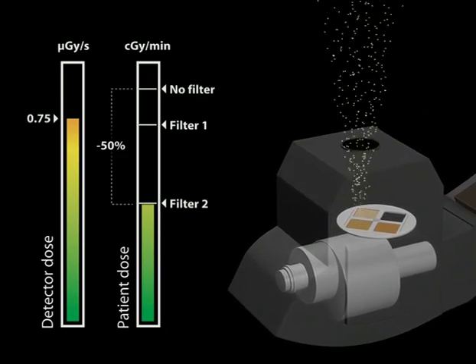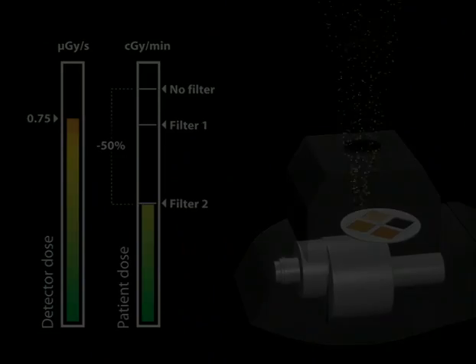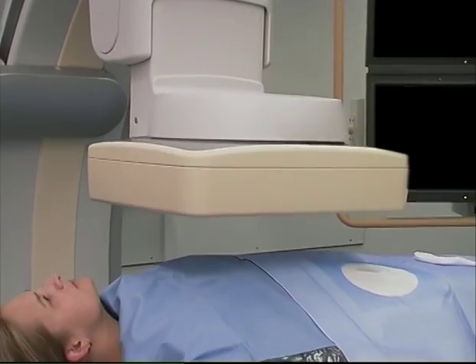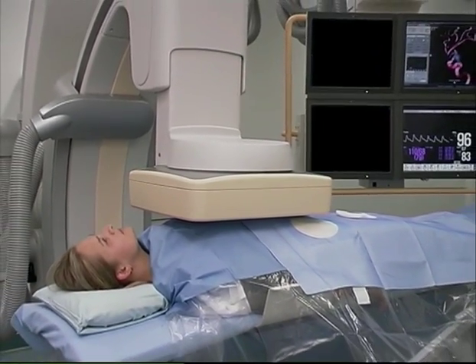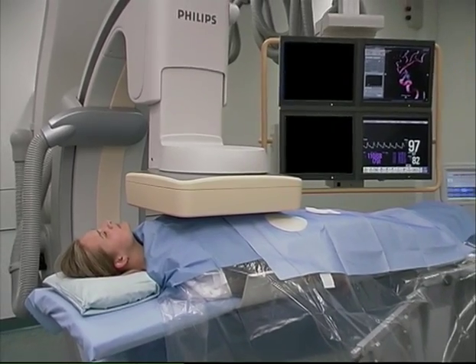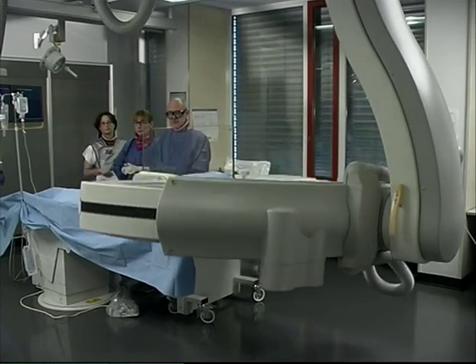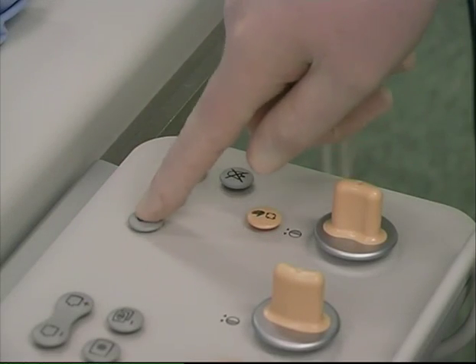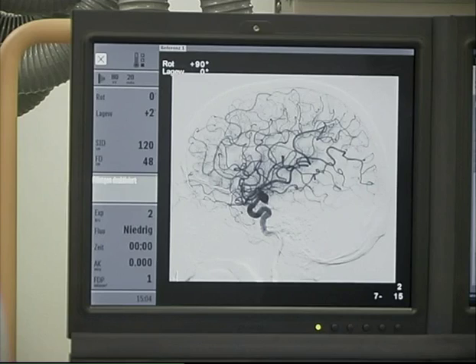The system's optimized examination programs have to be used. Every X-ray system for interventional techniques has an automatic function for adjusting the fluoroscopic and radiographic parameters. Since these adjustments are automatic, they should always strike a perfect balance between low dose rates and high image quality.